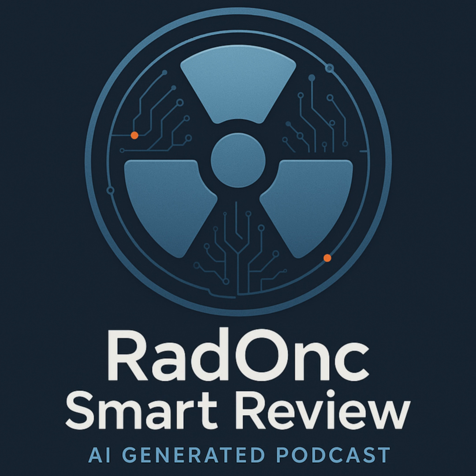But still limited image quality, right? Right, because of the MV physics. Compton scatter dominates at MV, so contrast is poor. That's why for image-guided radiotherapy, IGRT, we often lean on onboard kilovoltage, kV, imaging. Because kV X-rays give better soft tissue contrast. Much better. More photoelectric effect. You can see soft tissues much more clearly.